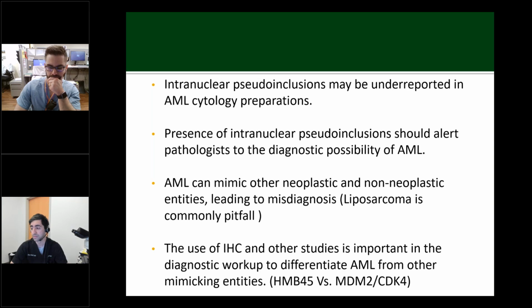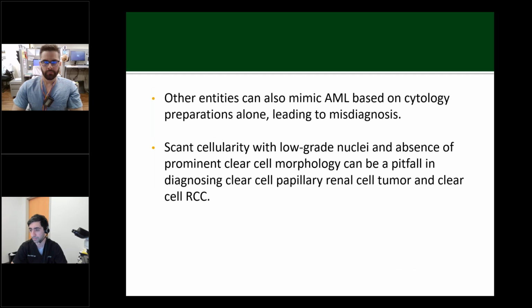One of these was favored to represent dedifferentiated liposarcoma at ROSE. Spindle cells and adipose tissue were seen on touch prep, demonstrating the misdiagnosis of dedifferentiated liposarcoma as a potential diagnostic pitfall, especially considering liposarcoma is commonly included in the radiologic differential diagnosis with angiomyolipoma. That's why we use IHC and other studies that help us differentiate between these entities.